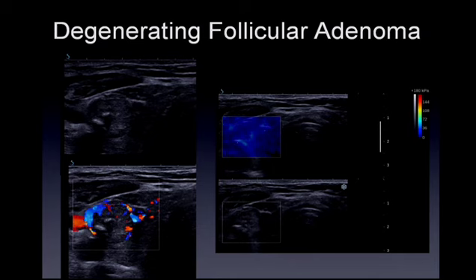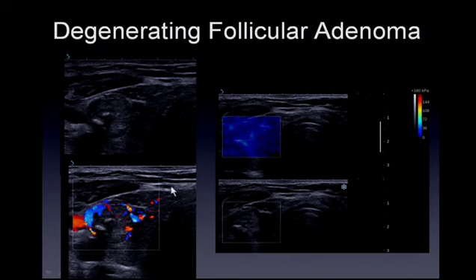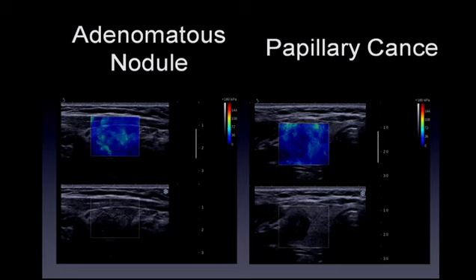This case of a degenerating follicular adenoma is very similar in B-mode appearance to the previous papillary cancer. There is some blood flow mostly in the periphery. On shear wave imaging, values are approximately 30 kilopascals. Both the follicular adenoma and the previous papillary cancer have very similar elastography characteristics. In another comparison case, an adenomatous nodule versus a papillary cancer shows similar B-mode and elastography characteristics—in fact, the benign nodule had higher velocities than the malignant nodule.